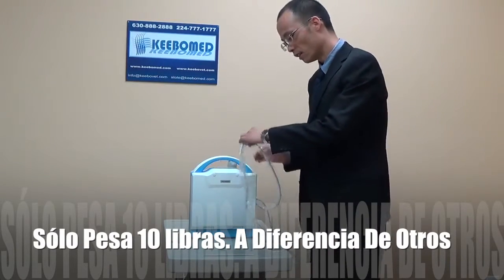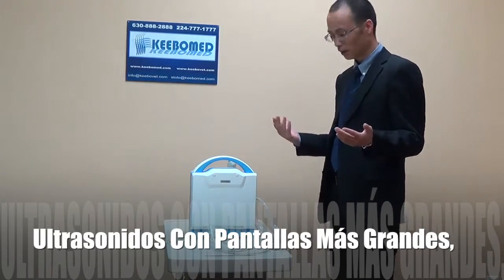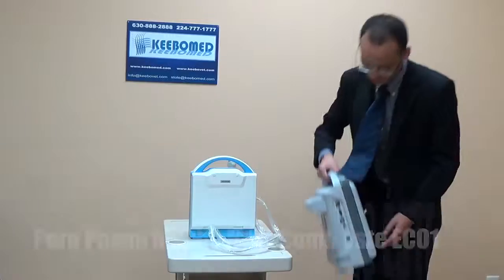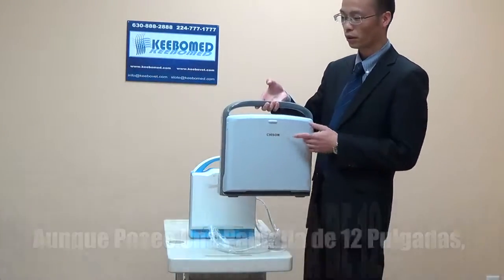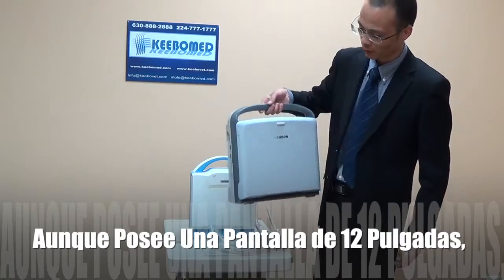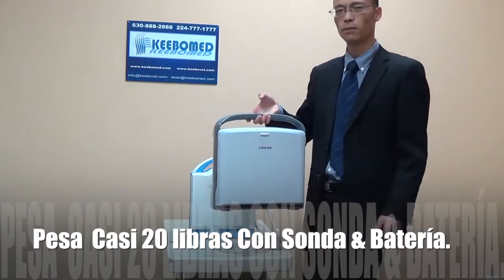Not like others with a bigger display, this one — Echo 1 — has a 12-inch display, but it is very heavy. Including the probe and the battery, it should be around 20 pounds.